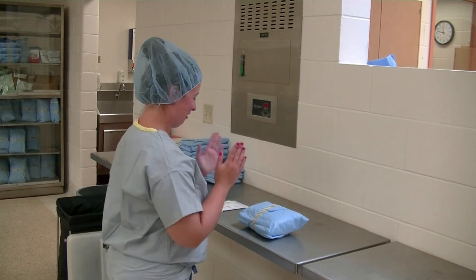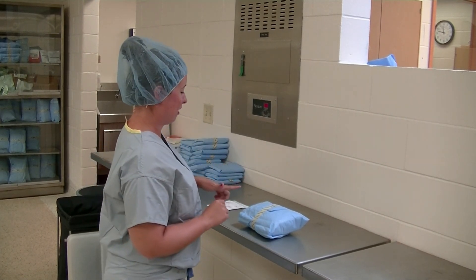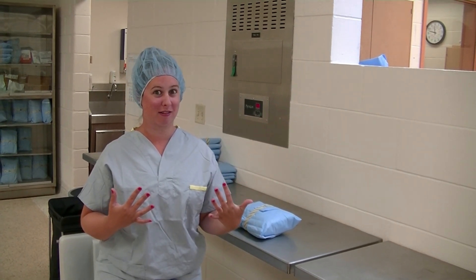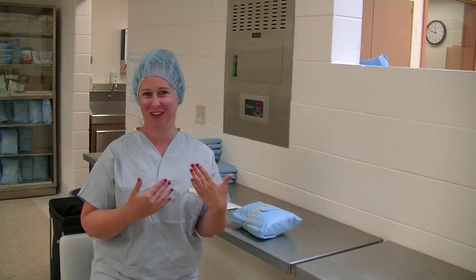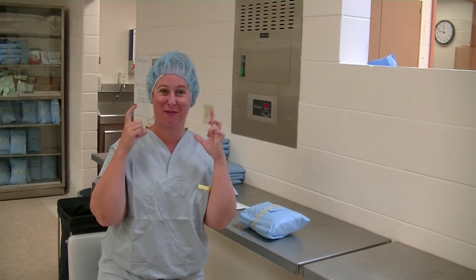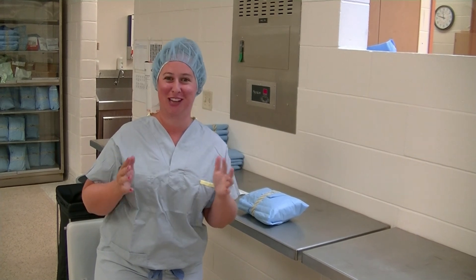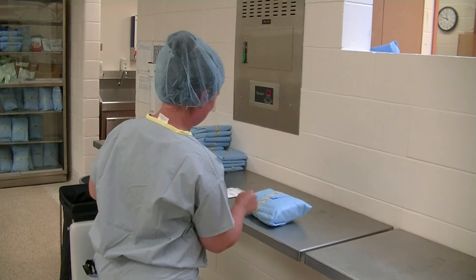We're going to be doing our gowning and gloving video. There are a couple of things that are inappropriate for junior surgery. First, I am wearing nail polish — you cannot wear nail polish when you come to junior surgery, you have to take it off. Second, I am not wearing a mask, for the convenience of you being able to see what's happening and to make the audio clearer.